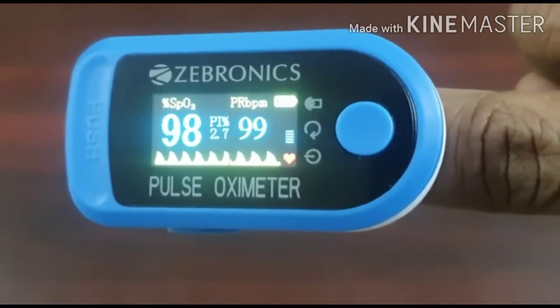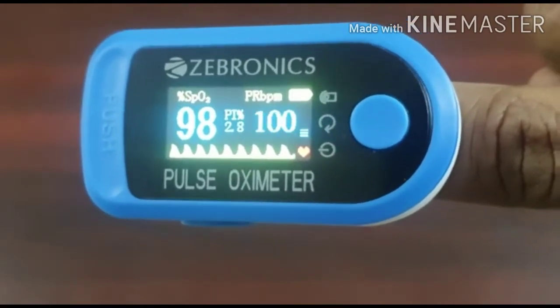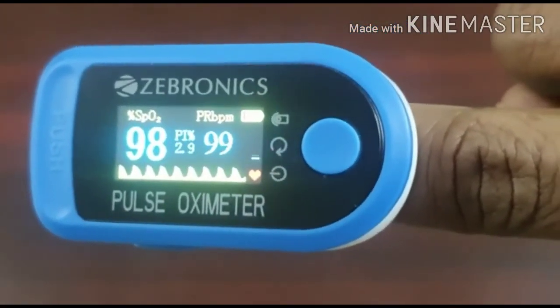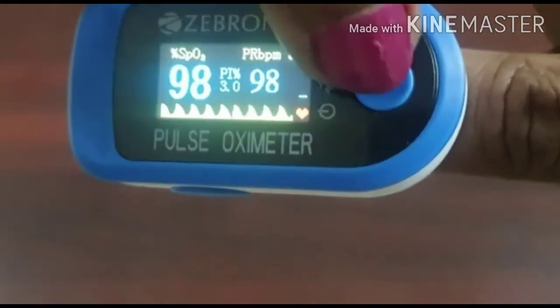Once it has given around three readings, you can switch it off. The oxygen level in my blood shows 98, and the pulse rate has ranged from 98 to 100, so we can take it as 99. We can switch off the device and keep it aside.